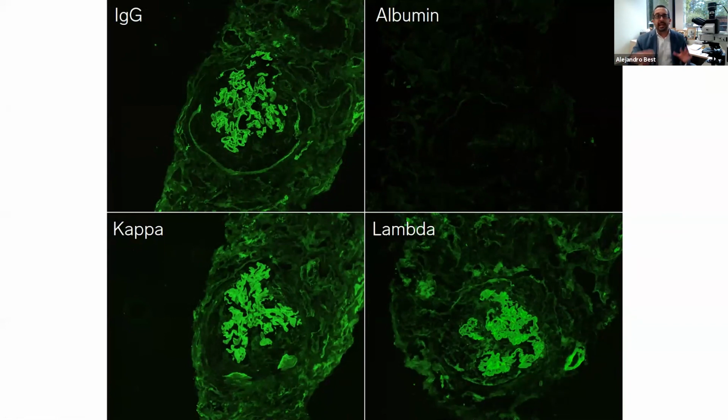So let's use diabetic as an example. Diabetic glomerulus membranes are frequently pretty bright. They have a significant autofluorescence, but they will stain similar for G and albumin. So you're like, okay, this is not pathologic. It's just part of diabetic nephropathy, part of the spectrum of the disease. However, if you have really bright G with no albumin, then that's abnormal, right? Because your control is basically negative.